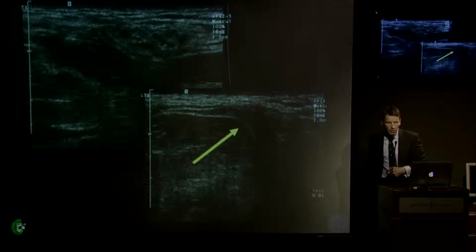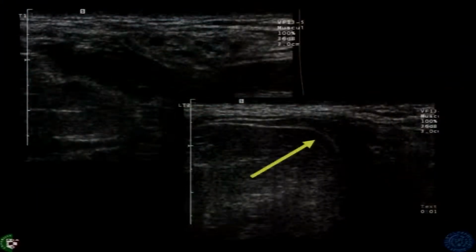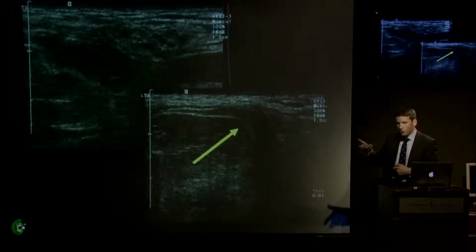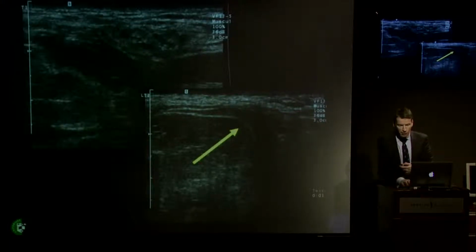And again, we've done a series of 34 asymptomatic, or largely asymptomatic, young academy footballers over 4 years, and they had a wide variation in what happened, and it didn't relate to symptoms. You can have the canal rotating as they strain, you can have it staying where it is and expanding, or you can have it being compressed, and it doesn't seem to make any difference.